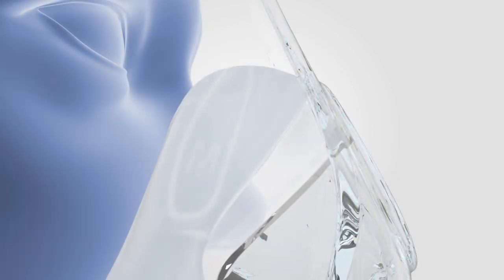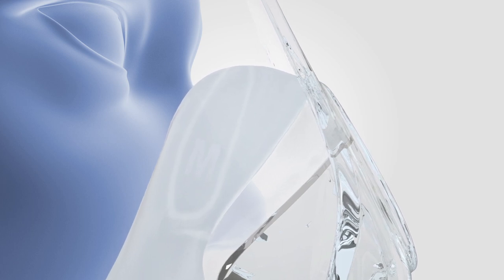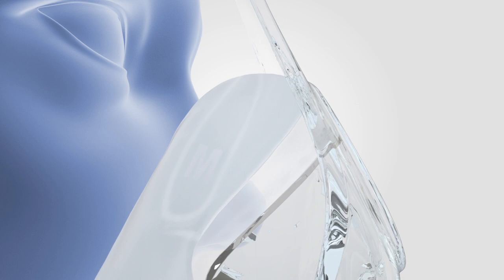The RollFit seal is designed to roll back and forth on the bridge of the nose to accommodate a range of face shapes. However, if it's pushed all the way in, it may impair mask performance.